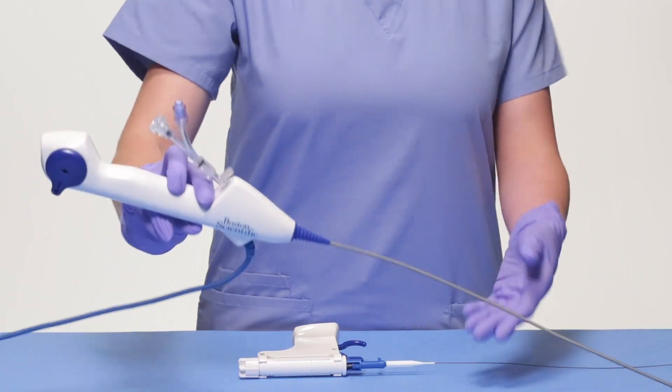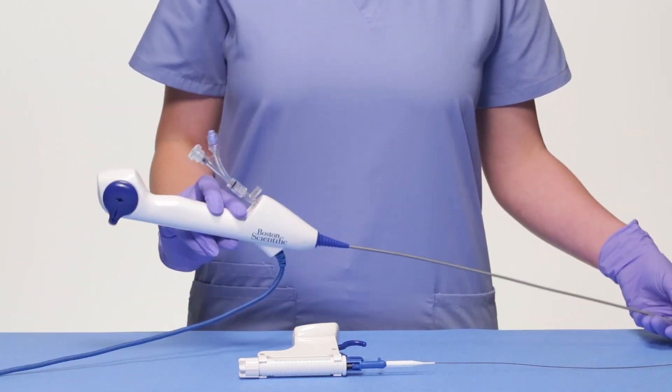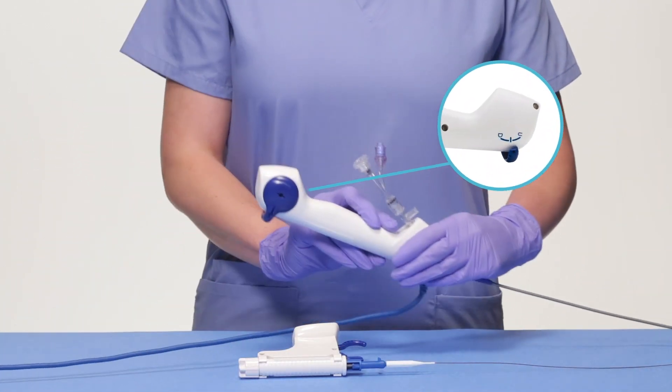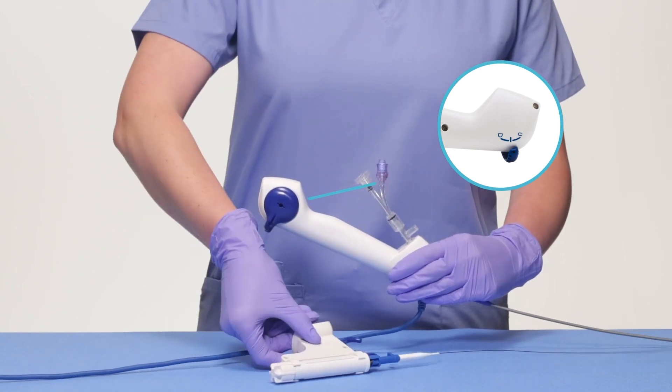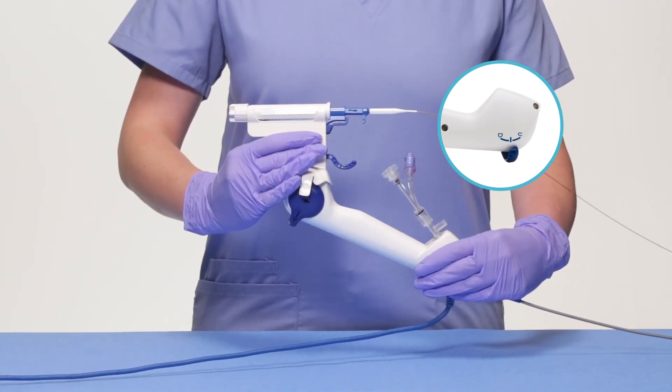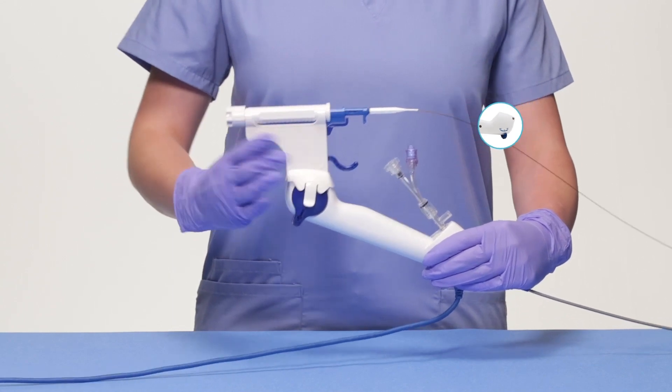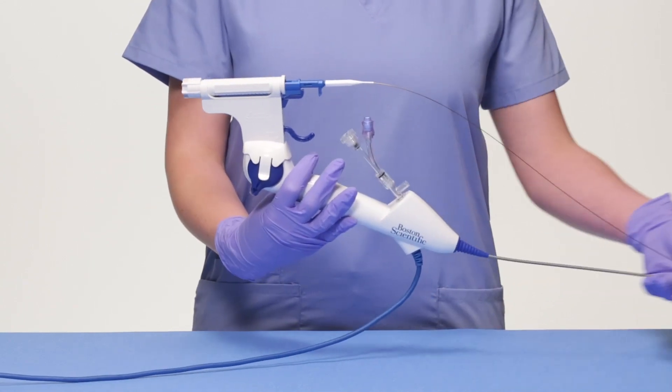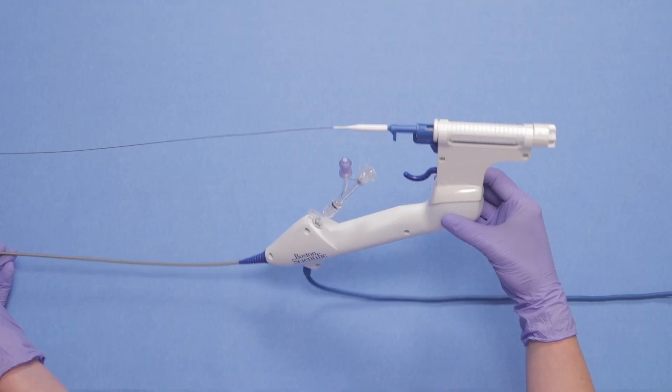To connect the LithoVue Empower device to the LithoVue ureteroscope, you must first align the pin with the DU markers on the ureteroscope. This side must be attached first for the device to function properly. When aligned correctly, pressing down will snap the device into place.